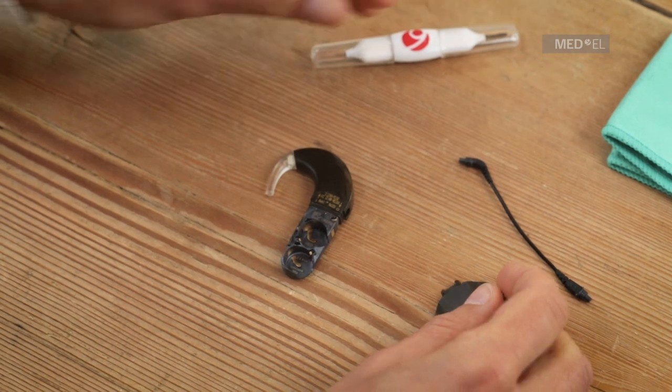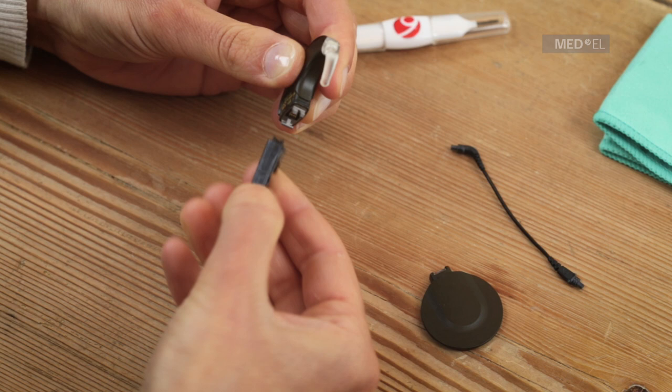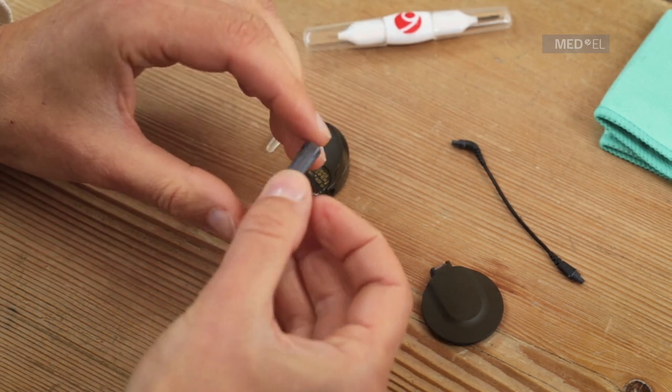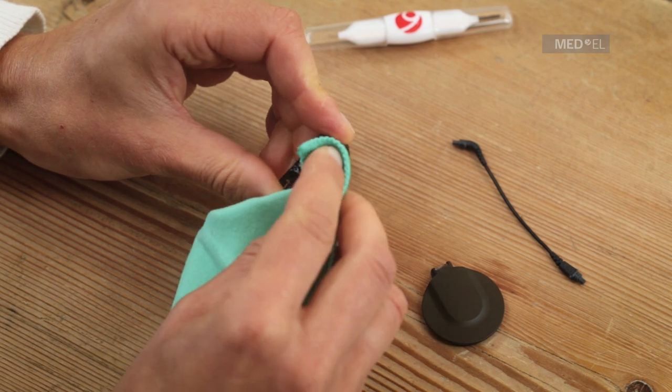Check each part for dirt, moisture, or signs of damage. If any parts appear dirty, gently clean them with a soft absorbent cloth. If any parts are wet, wipe them dry. If any parts appear damaged, you should contact your CI center for assistance.